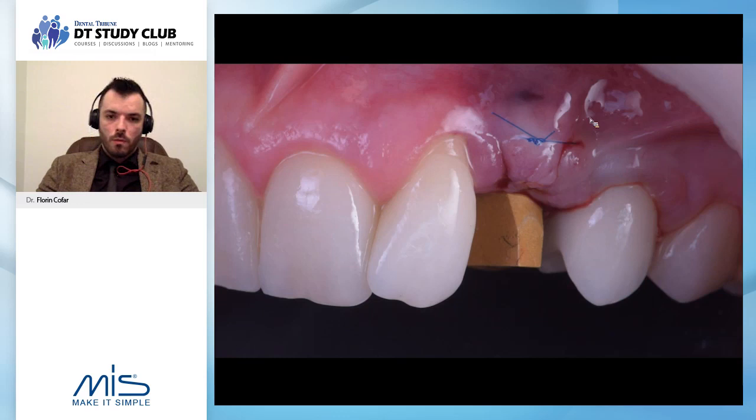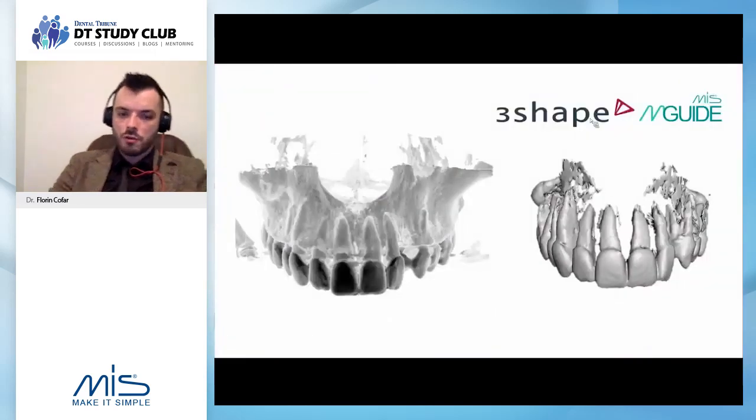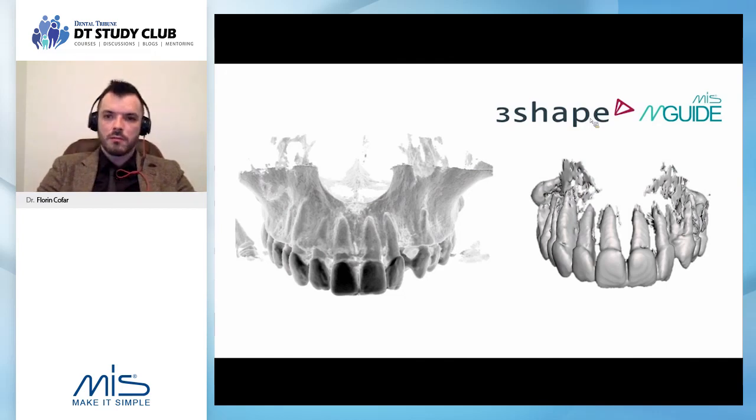Now there's two ways you can do it. After you put this, you can either put a scan body and scan them. This will give you the implant position. And now let me show you some nice things that we can do using the tools that we have.